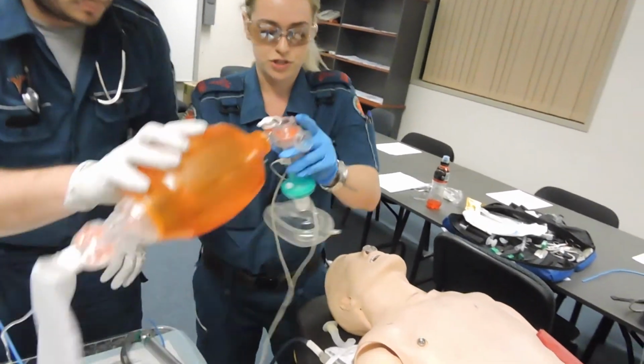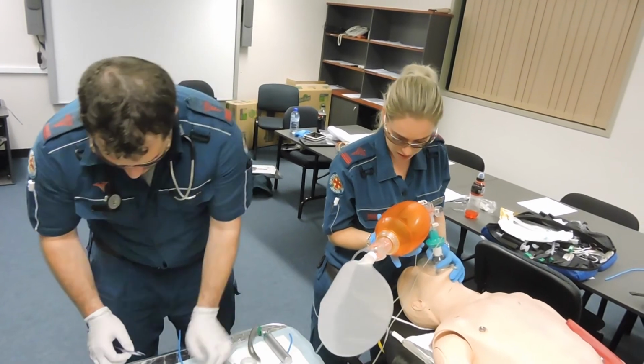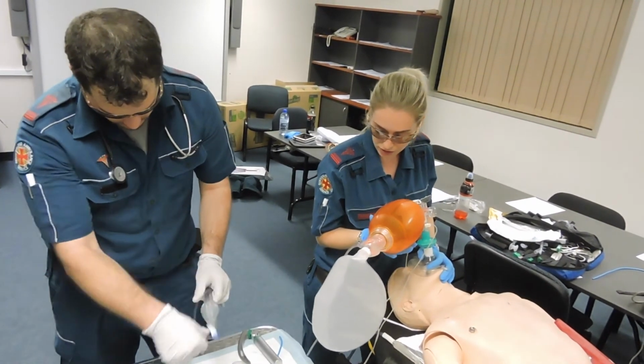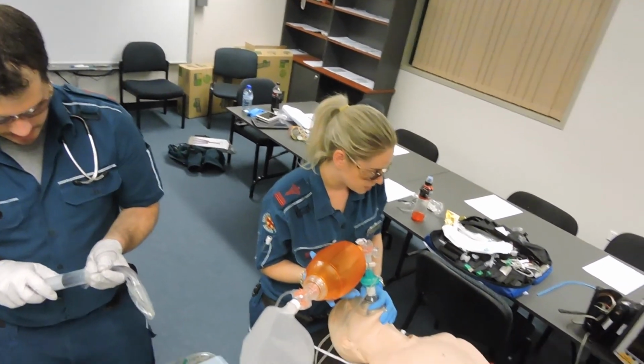We're going to revert to oxygenation once again. Yep. Alright, Ben. I'm ventilating with an OP and bilateral nasos. Yep. Can you set up a size 4 LMA for me with 35 mils of air in the 50 ml syringe and lubricated? Getting our oxygenation up, our sats are improving.